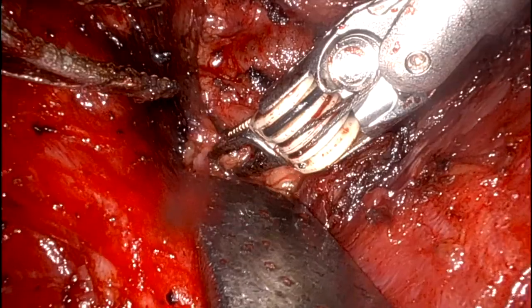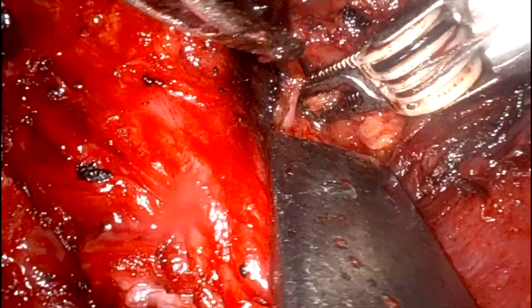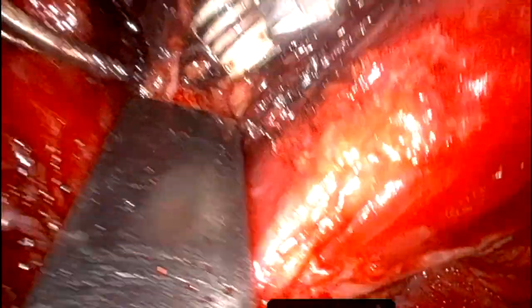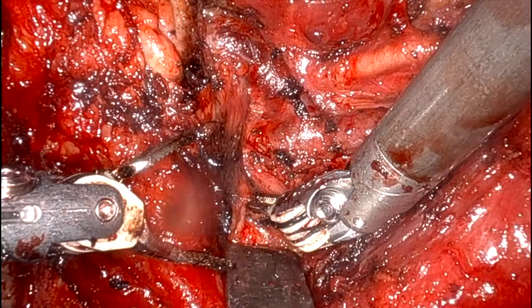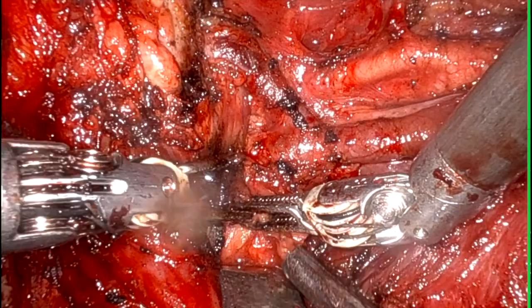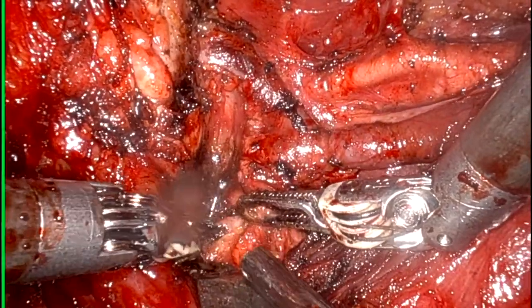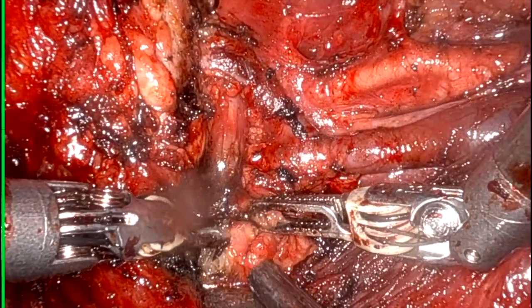Level 2B dissection is a little difficult, but you can do it. You need a little more camera adjustment, a little more retractor adjustment, but it can be done. So as you can see, I have zoomed my camera out, taken my camera back, and now I can see level 2B very clearly, and I start dissecting.